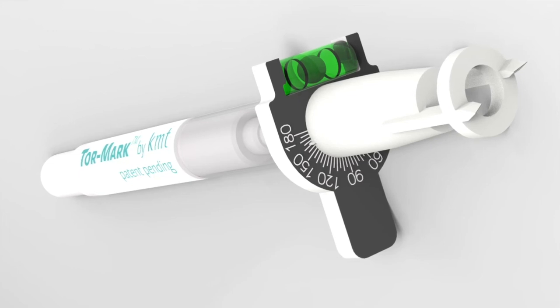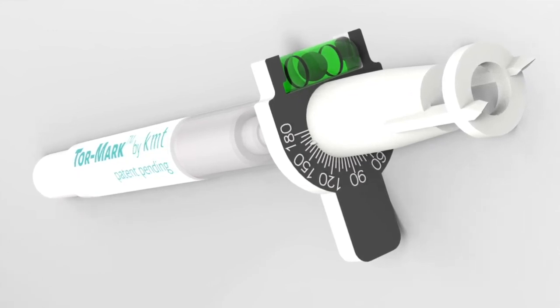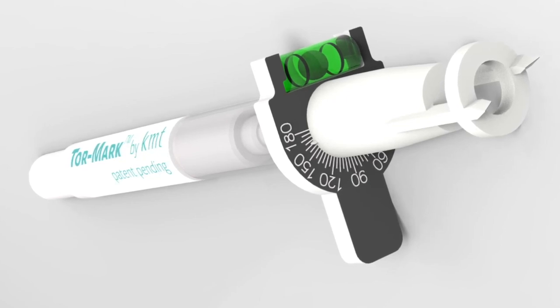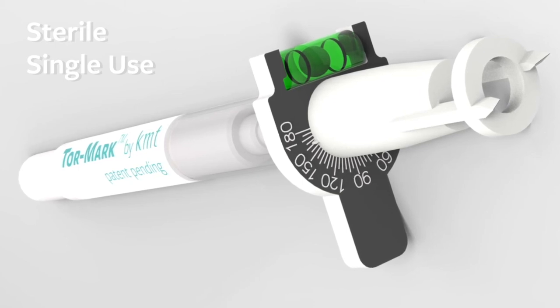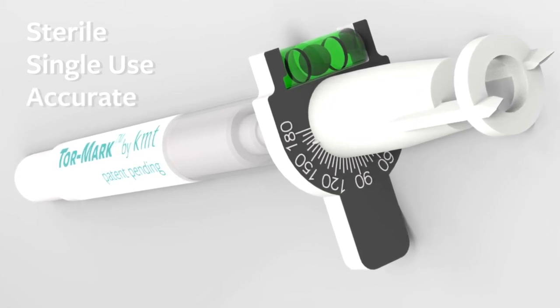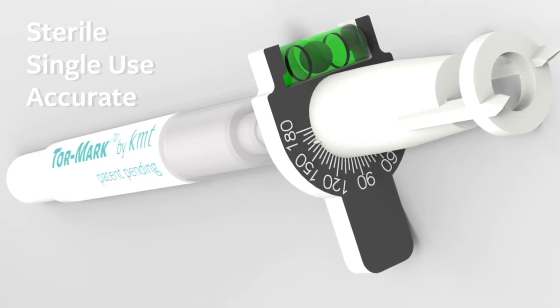This is a marking device to be used with any toric intraocular lens during cataract surgery. Some of the advantages of this device compared to regular standard devices is that it comes sterile, it's a single-use device, it's disposable, and it provides very accurate marks on the eye compared to the standard two-step marking devices.